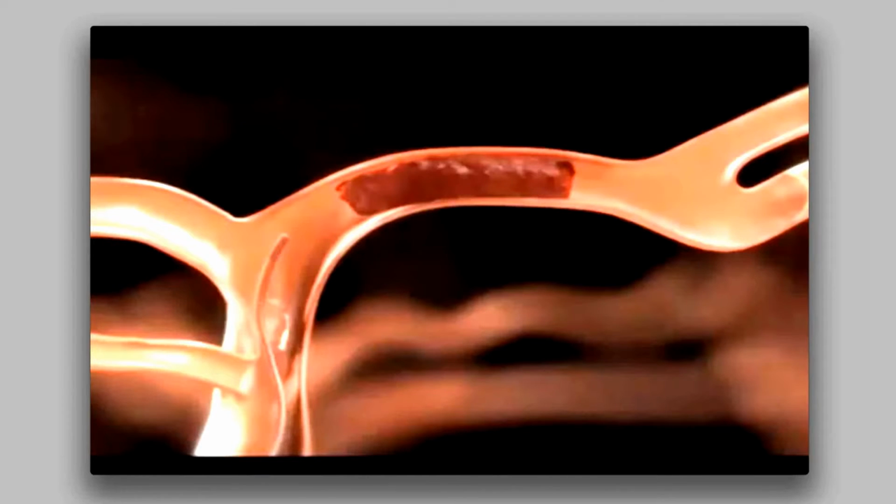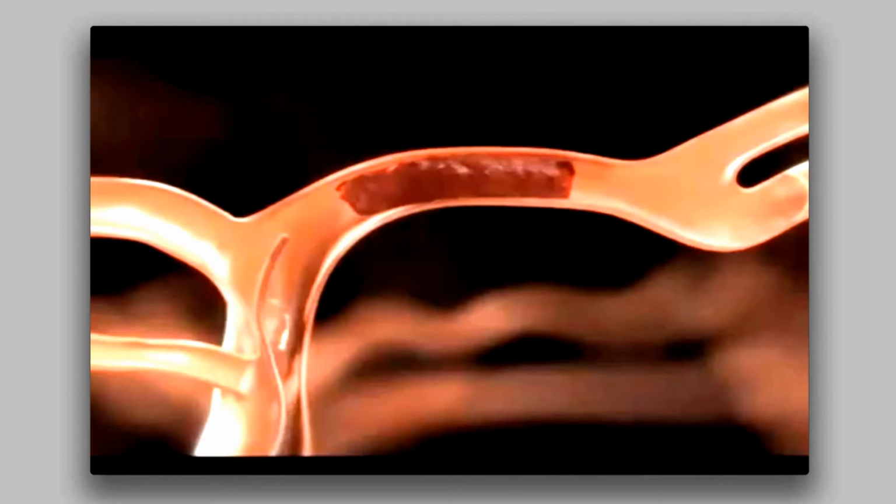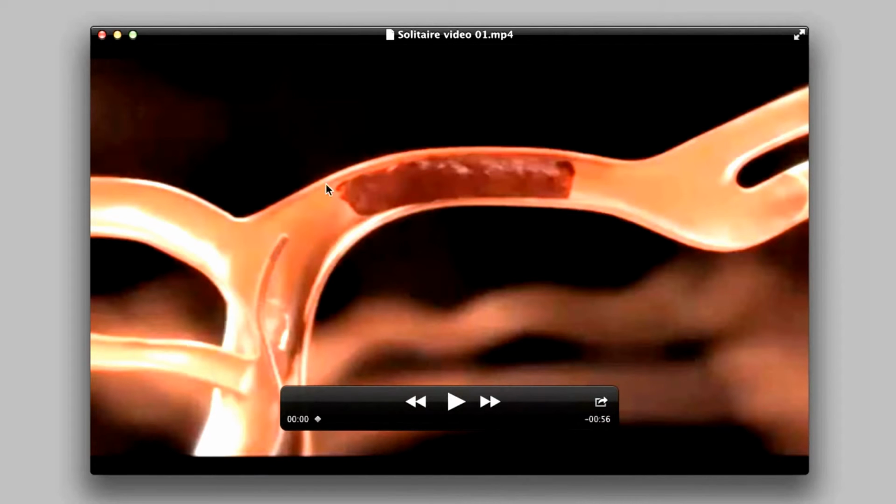In this video, we're going to look at how endovascular stroke treatment works. In the most common type of stroke, called an ischemic stroke, a blood clot has blocked an artery inside the brain. When we're treating a patient with acute ischemic stroke, the goal of therapy is to open this artery, to remove the blood clot, which can be done either by giving a drug called TPA intravenously, which circulates through the arterial system and dissolves the blood clot, or by means of a mechanical treatment called endovascular stroke treatment, where we deploy a device to literally pull the clot out of the artery inside the brain.